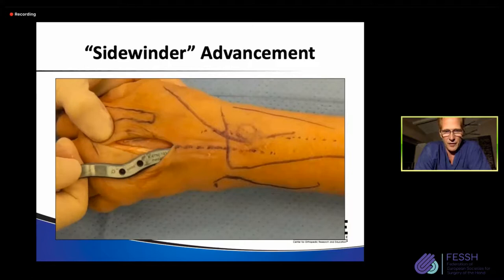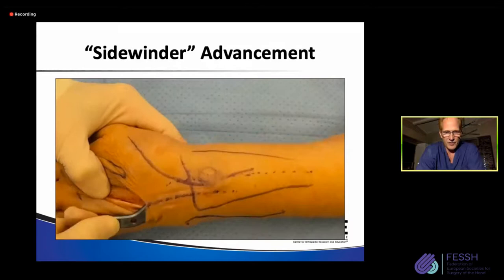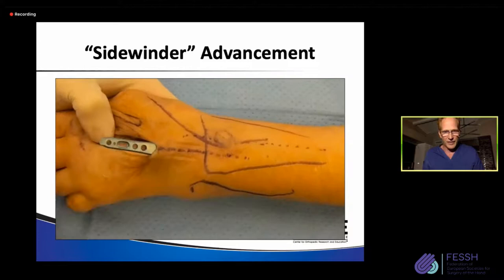You feel a little bit of resistance here because you're actually pulling against some of the muscles and the tendons. You're sliding it along the bone. And then it'll suddenly give very easily as the curvature of the carpus settles down right there. So there's a little pop and it tells you exactly where to leave it.